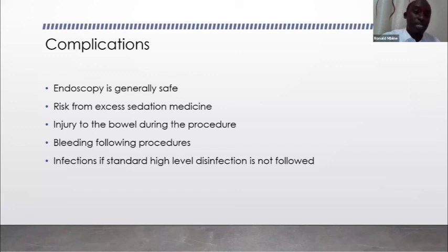For procedures like I showed you, where you have to cut a tumor out endoscopically, we admit the patient and observe them. Endoscopy, also, if standard operating procedures are not followed, can be a conduit for infection. If the endoscope is not appropriately cleaned, there's something we call high-level disinfection. Because those tubes are rubber, you cannot cook them, what we call autoclaving.